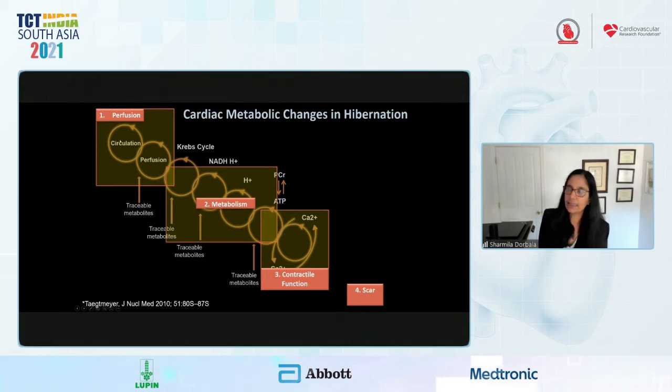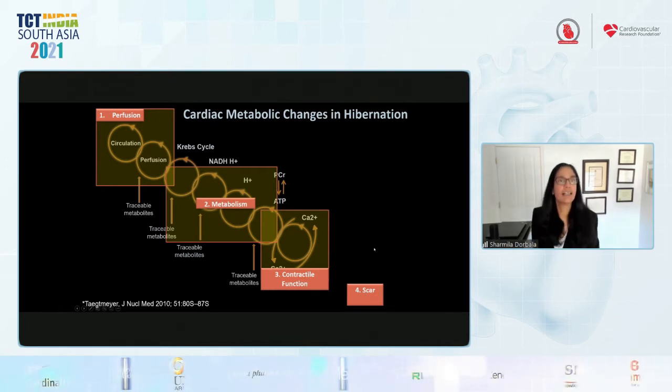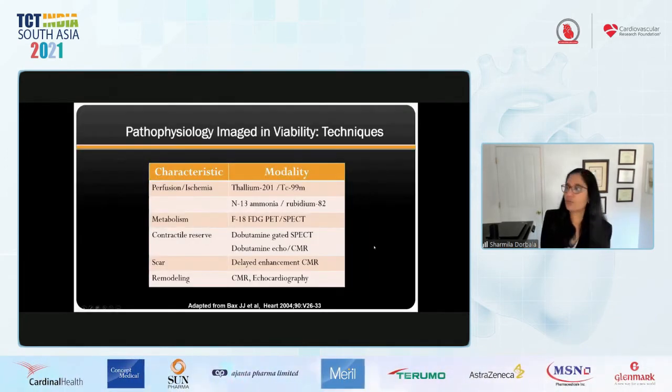Therefore, any technique that relies on imaging perfusion is likely to be sensitive. Any technique that relies on imaging contractile function is likely to be more specific. And of course, scar indicates that this area is unlikely to recover function.